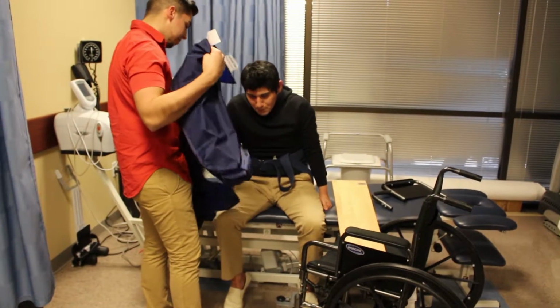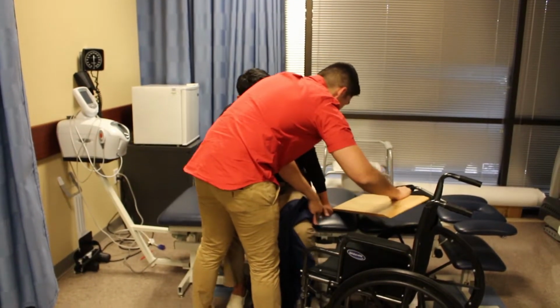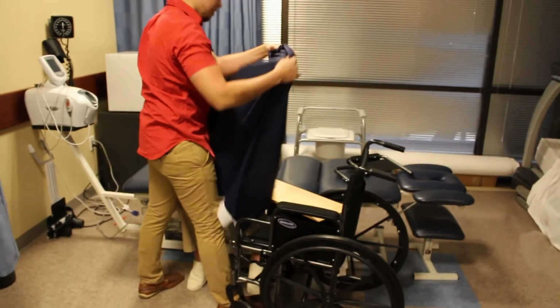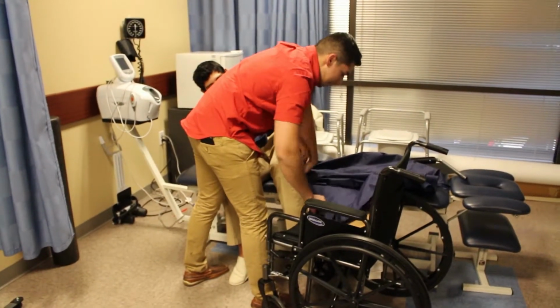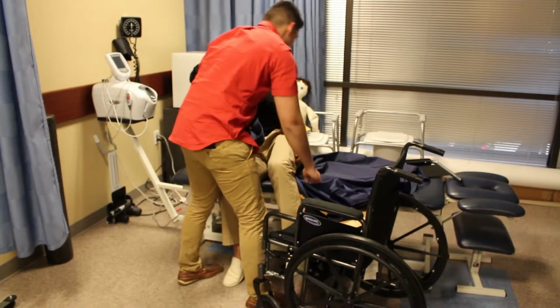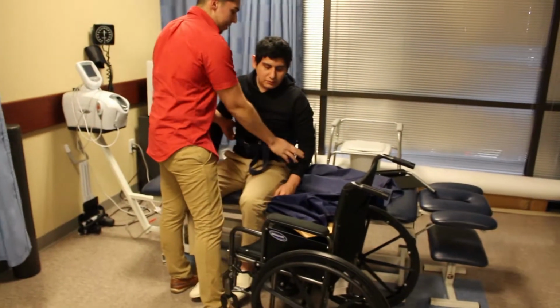Hold it in half. Put the sliding board under him. Next, put this sliding sheet under him. You don't want to wrap the sliding sheet around the sliding board, just right on top of it. Come back this way.